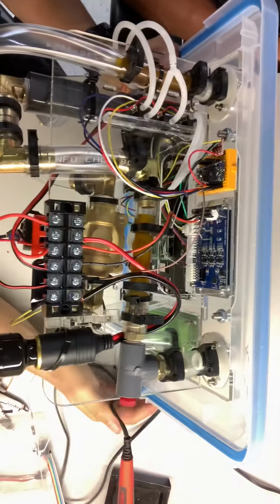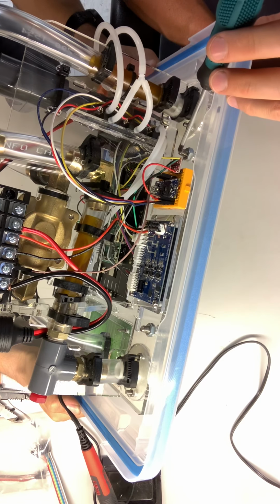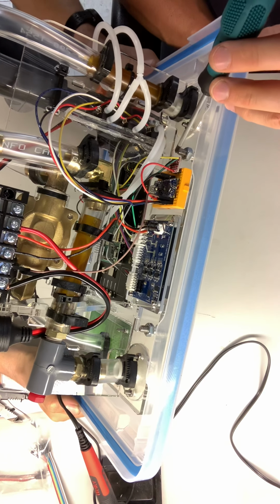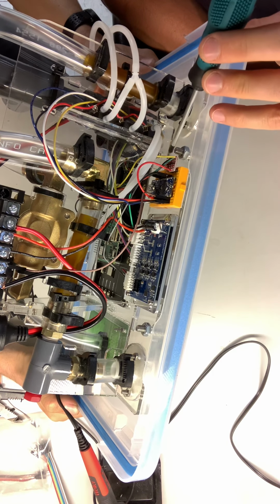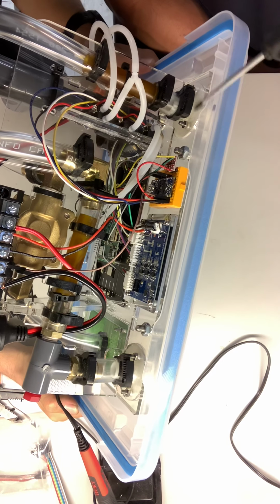Sweet. On the other side of the level shifter, we have yellow, which is in the end. What is that signal? Oh, it's just serial communication. So yellow and green are serial communications. For the RPi? From the Arduino to the Pi. So we have them on the other side of the level shifter. They're going over to the RPi. We'll go visit them in a second.